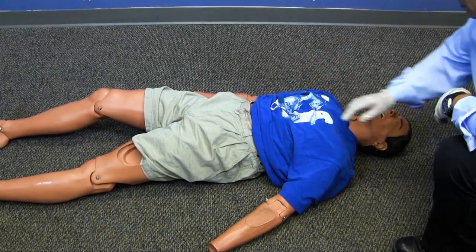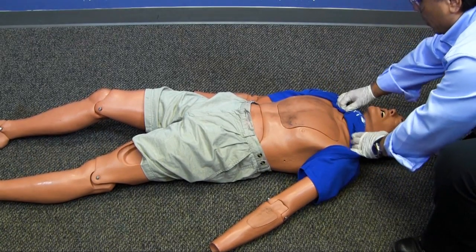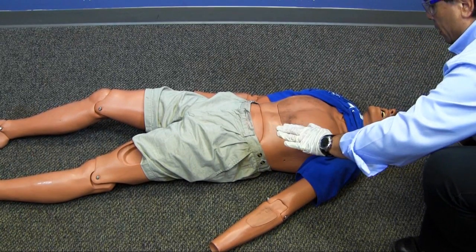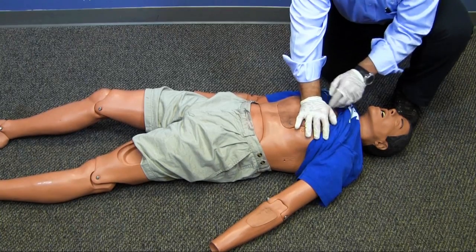My primary assessment reveals a pulseless apneic patient who has had CPR performed. I expose my patient's chest, locate the correct hand position, and start quality chest compressions.